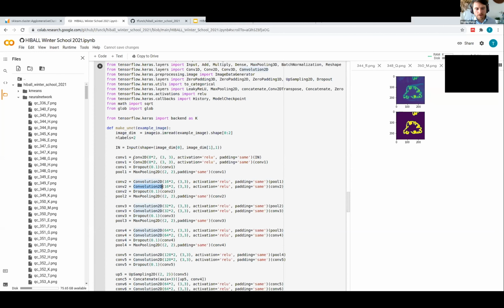layer. And what that does is it helps regulate the model and prevent it from over-learning and over-depending on a small subset of weights. What could happen is that you could have a handful of artificial neurons and weights between them that happen to just randomly be really good at predicting your training set, but may not generalize well. And so by randomly knocking out 10% of your weights, it prevents the model from finding this suboptimal solution.